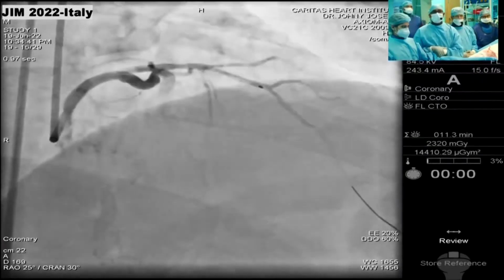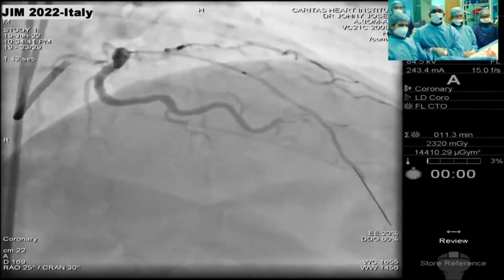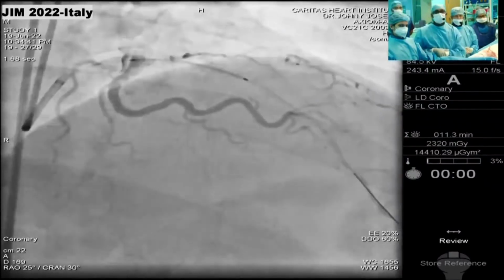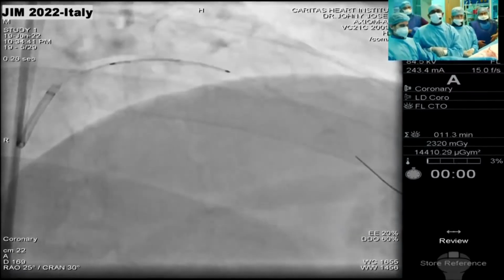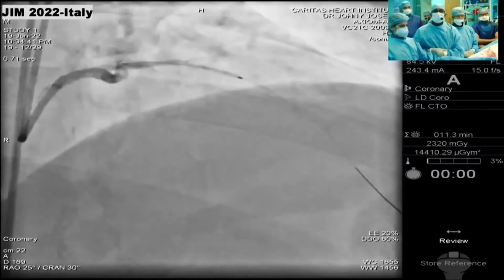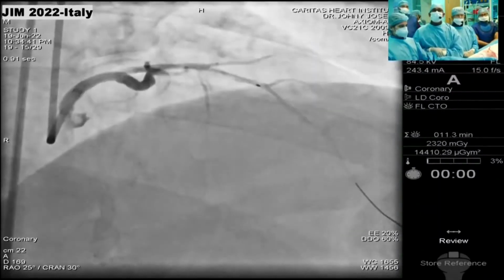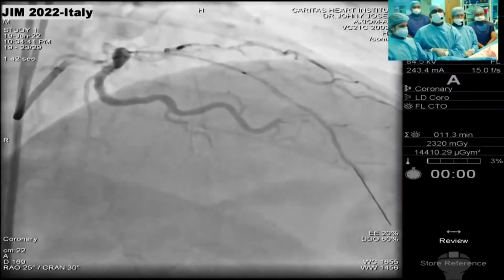But the calcium was mainly limited to the area of total occlusion. Yes, very true, sir. The calcium was mainly at the total occlusion. And when you dilated the balloon, the waist gave way relatively easily, right? Yeah, even at 10, 12 atmospheres, we were able to open it up. Okay, then that means we have a relatively good position now.